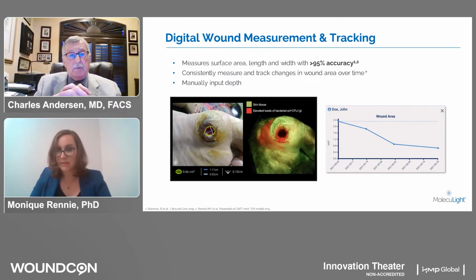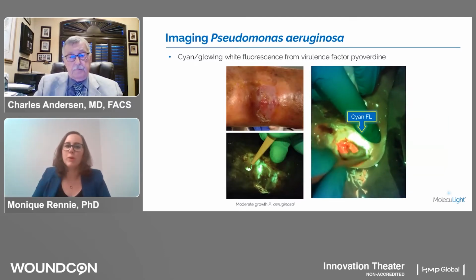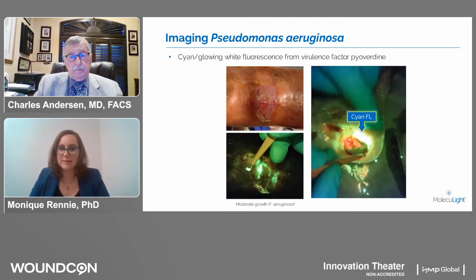Monique, can you talk a little bit about Pseudomonas and the detection of Pseudomonas with this device? Yes, that's a great question. So I mentioned that most bacterial species fluoresce red. Pseudomonas is very unique. I know it's unique clinically in its presentation as well, but it's also unique in how it presents on the images. So here are some examples of Pseudomonas. It uniquely produces a cyan color that usually has a glowing white center.